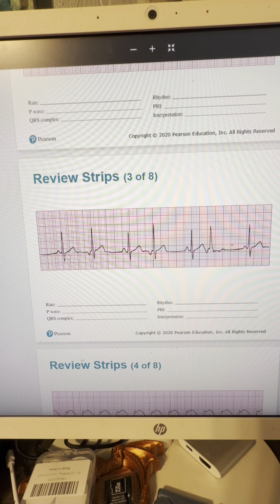This one, we have a sinus rhythm, and then we have a little guy. Oh, I'm sorry. This is bigeminal. Yeah, bigeminal PJC. So normal sinus rhythm beat, inverted P wave, normal, inverted, normal, and then we have a PJC here. It came early before the next expected, and then it resumes back to the sinus rhythm. You can measure out your PR intervals and all that stuff, but it's a sinus rhythm with bigeminal PJCs, and then another ectopic one here that came a little early.